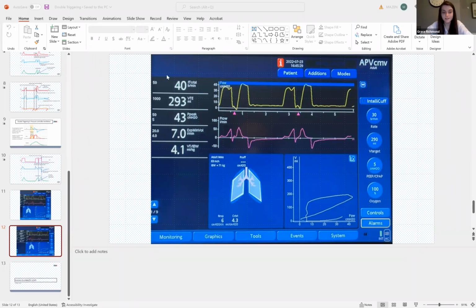Lovely, thank you for answering that question. There's been a question from the Facebook Live as well. What about decreasing the trigger threshold? Yeah, so that is going to solve the problem too.